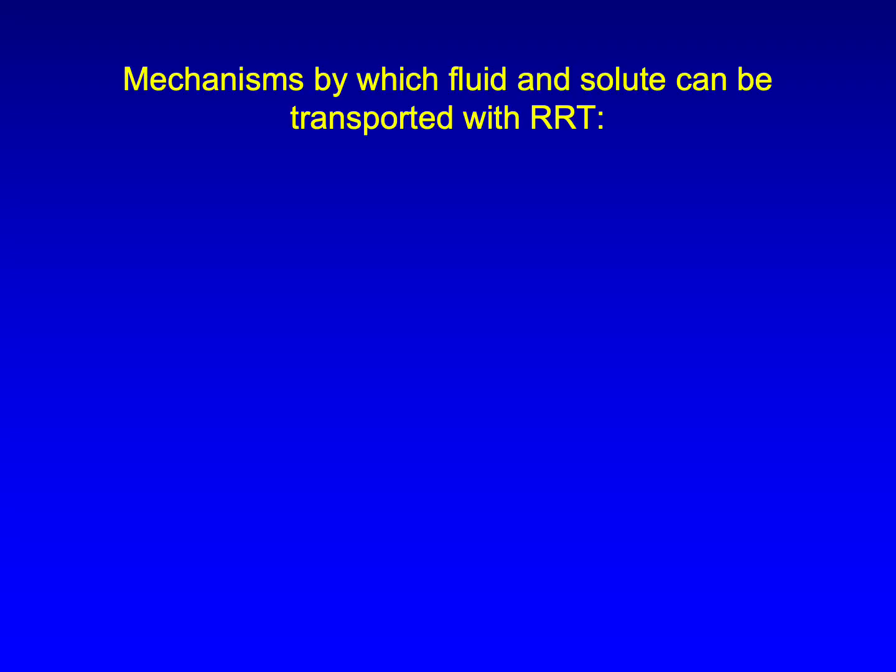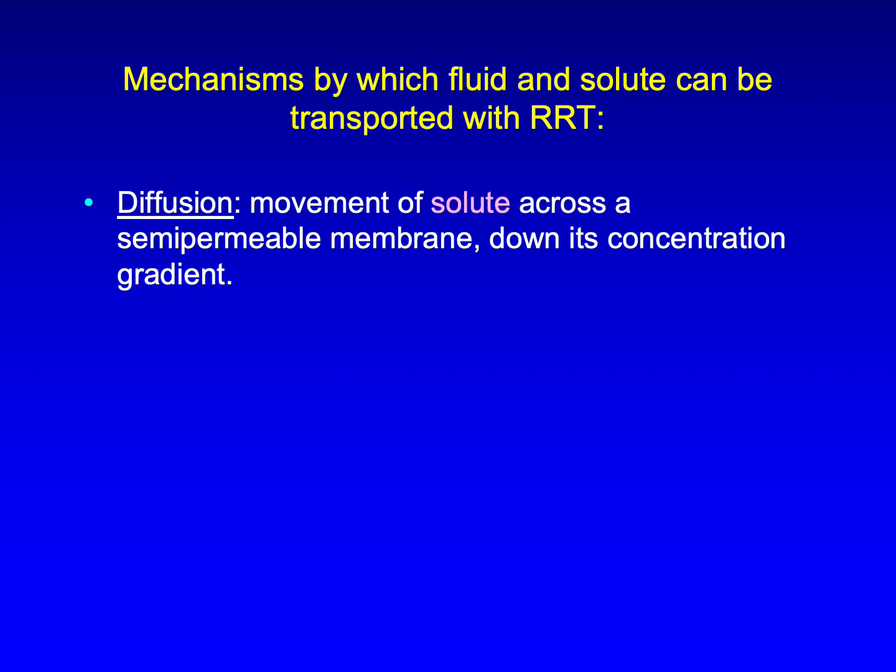So let's start with some basic terms that describe the mechanisms by which fluid and solute can be transported with renal replacement therapy. First, diffusion is the movement of solute across a semi-permeable membrane down its concentration gradient. Notice here that only the solute molecules move, not water.